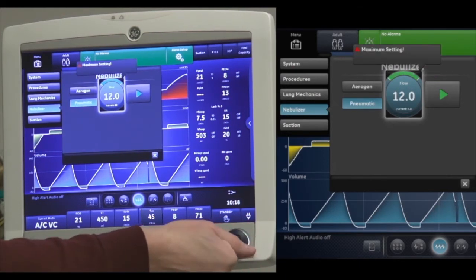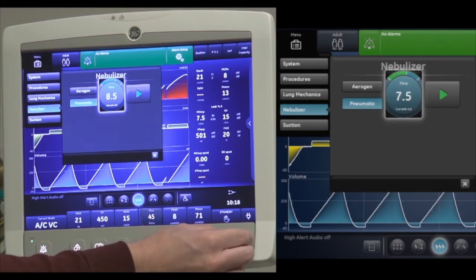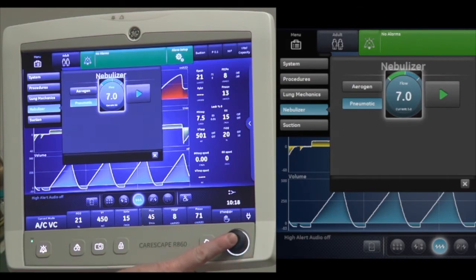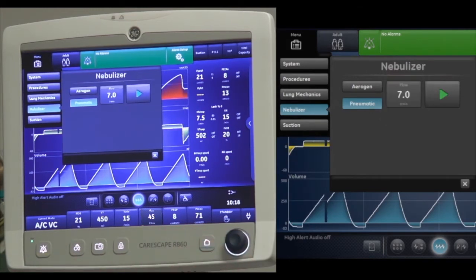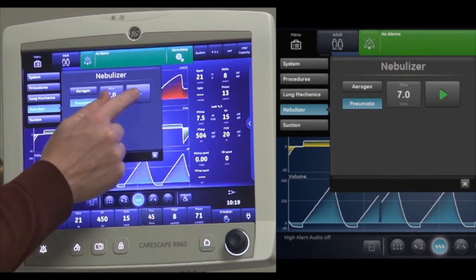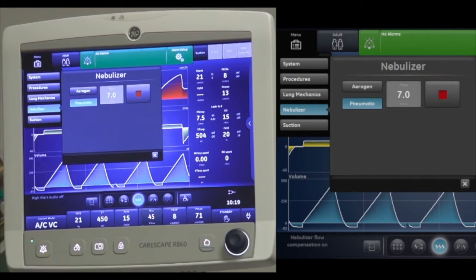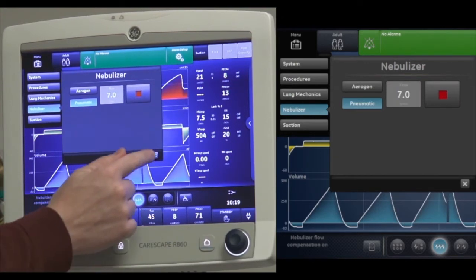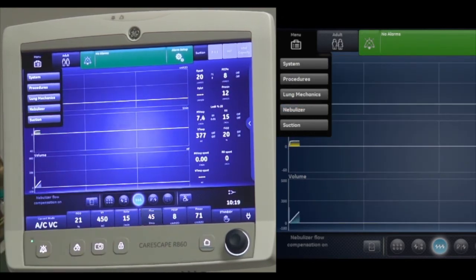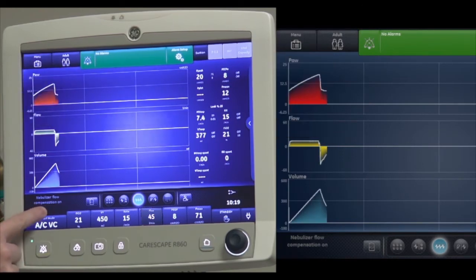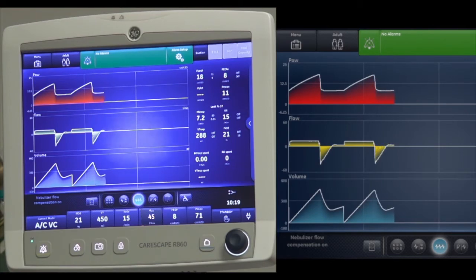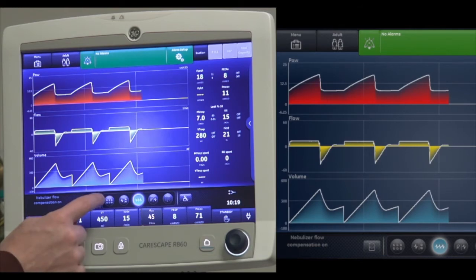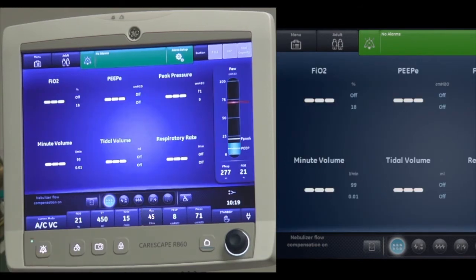For this example, I'm going to use seven liters per minute — say I have a wall source or external source of seven liters per minute. I'm going to match it and push the start button, which will compensate for the external flow. The message displayed is that nebulizer flow compensation is on in the lower left-hand corner of the display. My minute ventilation is now going to be accurate with fewer incidences of auto-triggering.